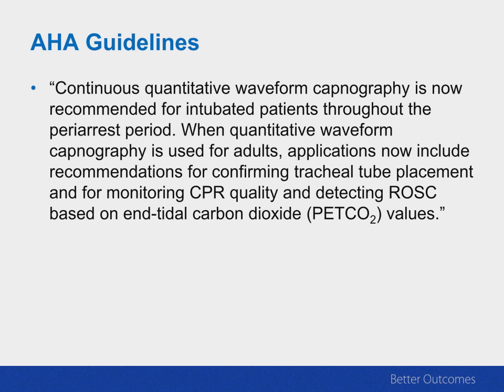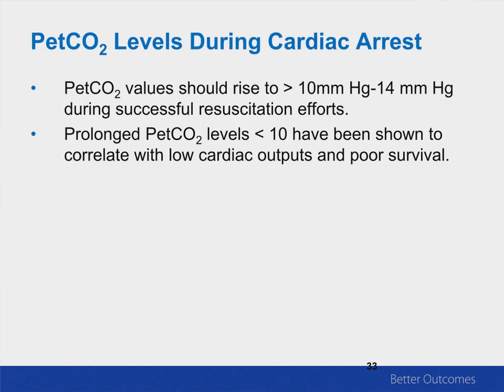Now, the AHA has said to put a capnogram in place, because this will help you identify when the person has return of circulation. Well, that's one of the most basic aspects of it, but it does work. There's really very little reason to check for a pulse if you have a capnogram on. And again, I'll show you that in a second.